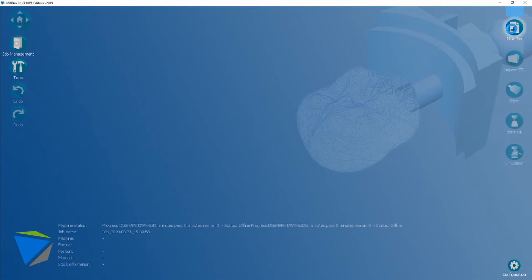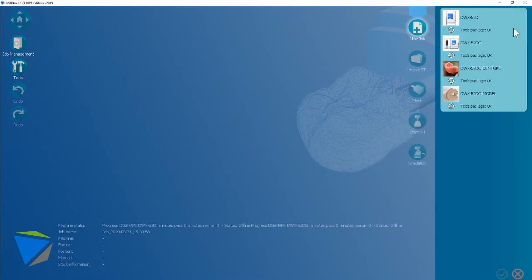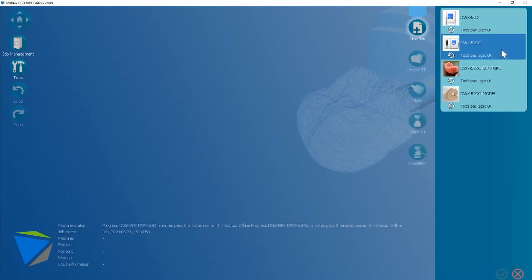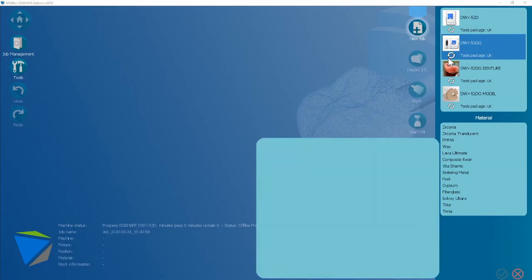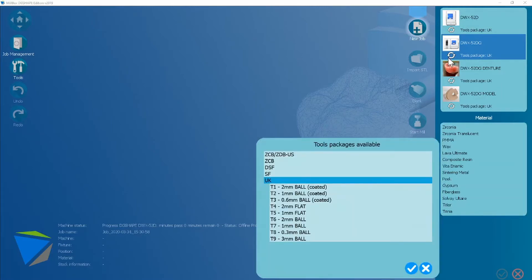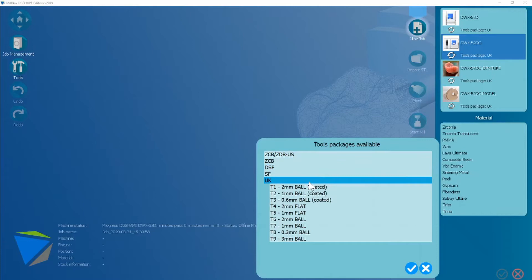We're going to click new job. The first thing you'll see is machine selection. I'll choose DCI and it's worth mentioning that you can select a tool package from here. It's best that you liaise with your dealer for which tools and tool package is best for you. But today I'm going to use the UK toolset which are all DG Shape branded tools.